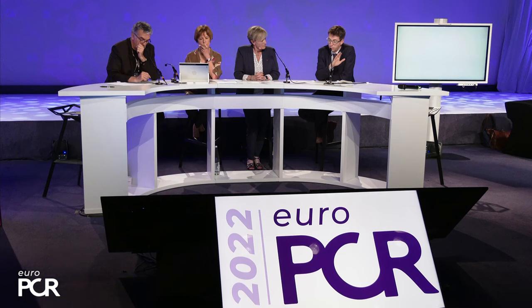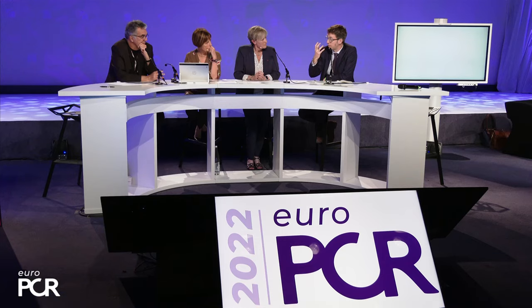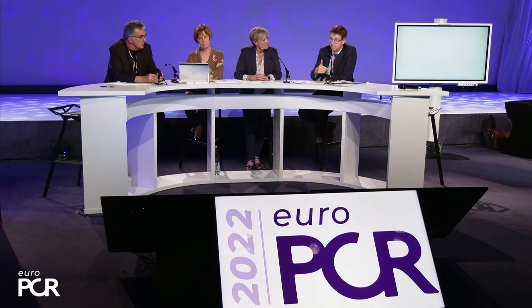And we've seen some very interesting findings there. Depending on first operator or second operator, you would think the second operator may actually be less exposed. We've found that the combination of being a second operator and short is probably the worst possible combination, as the scatter that comes off the patient hits the second person much more. And if you're lower down towards the patient, you're getting it in your face rather than into the lead gown. So if you're in a position where you can monitor, it is probably the most educational element of understanding how to minimize exposure to yourself and your team long-term. Really, really important.